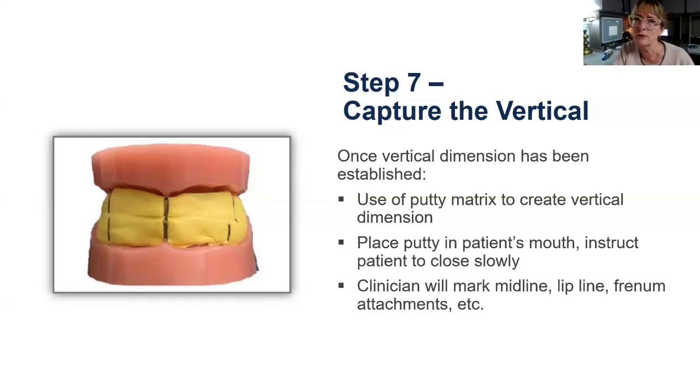I will share with you the lab technicians at NDX really don't like this slide. They don't like putty bites in general, but it's very much guessing what the patient's vertical might be. But for that fully edentulous patient, if you want to try to go directly into a try-in, it can be a good option.